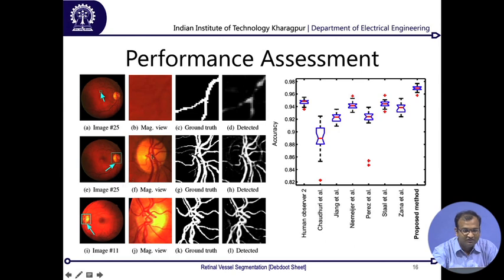The other problem is around this optic disc region, where you have different layers and overlapping vessels, and you can see that it gets predicted pretty discretely. The other challenge is that the ambient illumination intensity around this optic disc is pretty different for different images, and that is this comparison here. You still have the method doing it pretty fine.